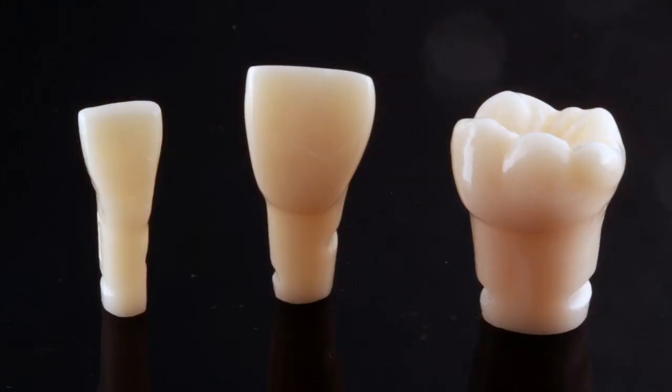The second option is to buy a full contour set from VIADE Products. What you do with a full contour set, you take a carbide burr and you shape your own prep out of these full contour tools. Of course, yes, that takes a little bit more time, but you get exactly what you want. And don't be afraid if you trim a little bit too much. You can always add wax to it and you can always reshape it with an instrument.